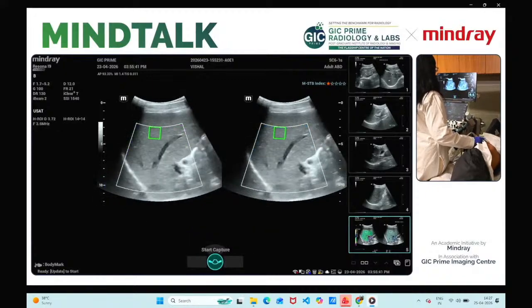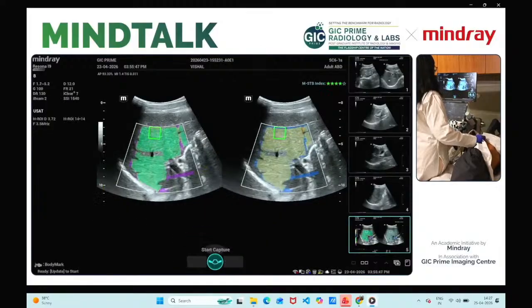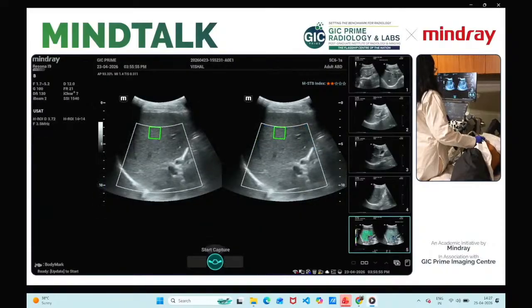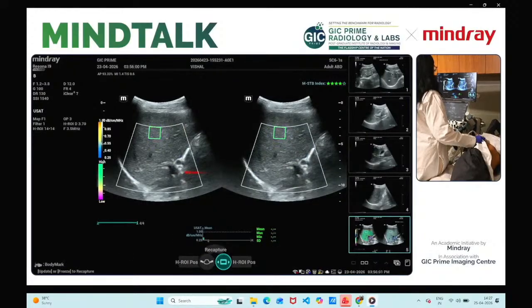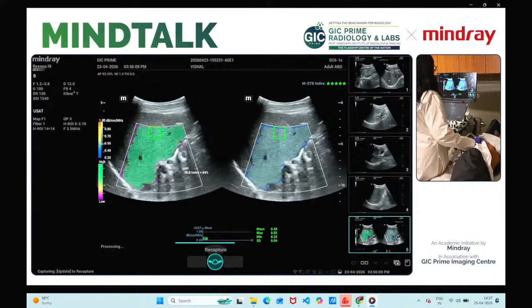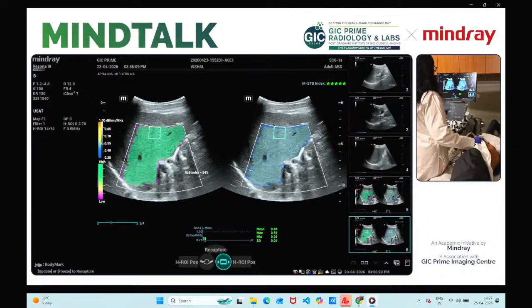I take multiple measurements. Total 5 measurements are taken. Here again, motion stability index is good. I am rejecting this image because the reliability index was not good. Here I have taken another measurement in which motion stability index and reliability index are good. Here the mean value is 0.48.